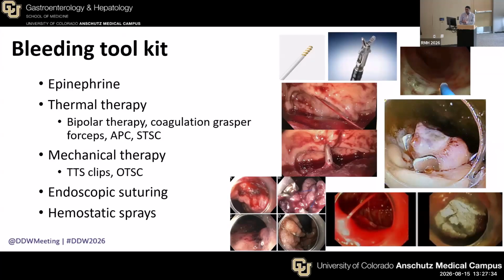So epinephrine injection, the oldest tool that we have. We never want to use epinephrine alone because it's only transient. It will only give you transient hemostasis and not durable hemostasis. So once in a while, we'll use it as an adjunct to help localize or improve our visualization.